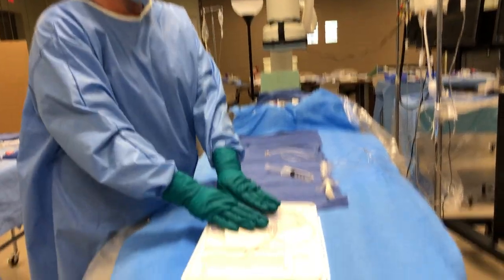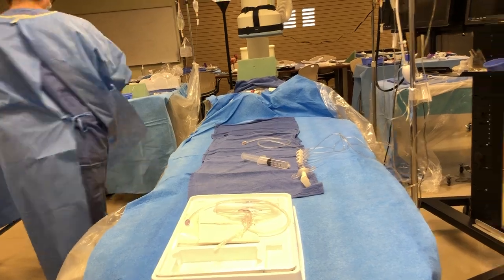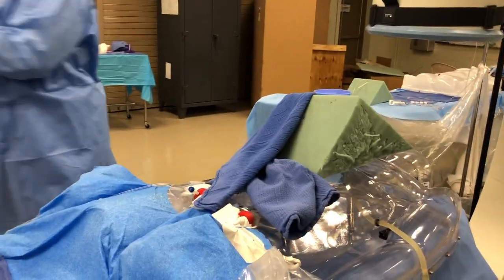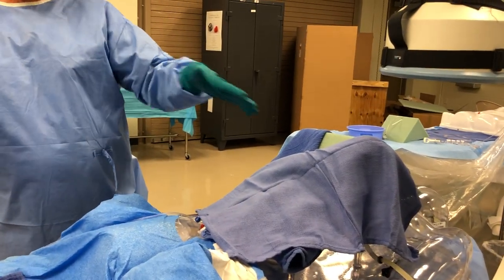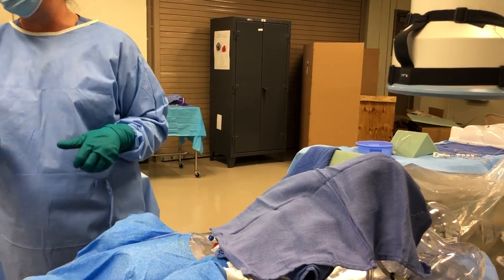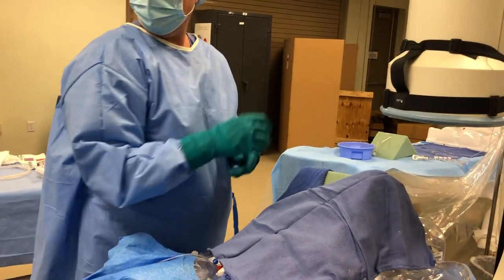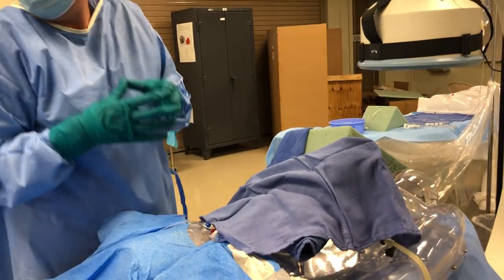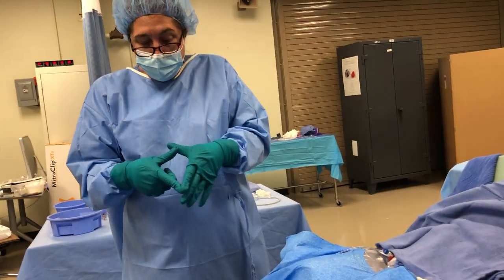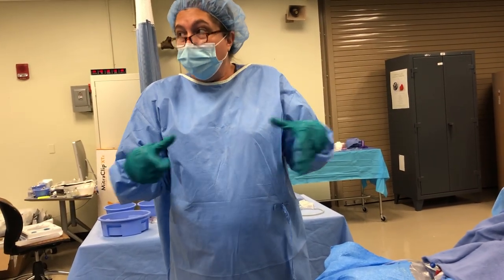What I need is not one of the first things I'm going to be using, even though it's on top. When draping, I'm going to section off my chest in a little triangular area. Start smaller than larger — we can always pull back out if needed, but we can never pull back up once we go too far.